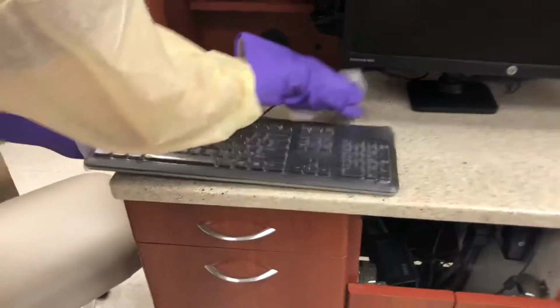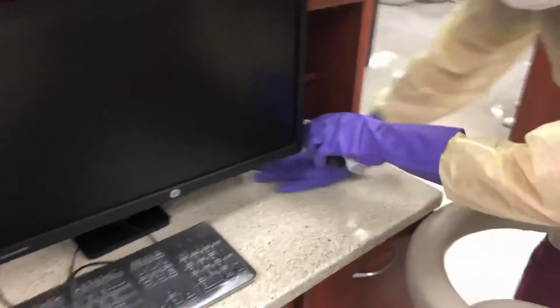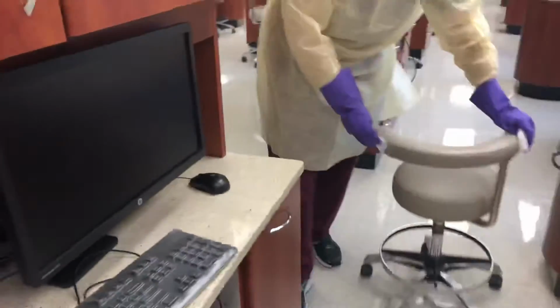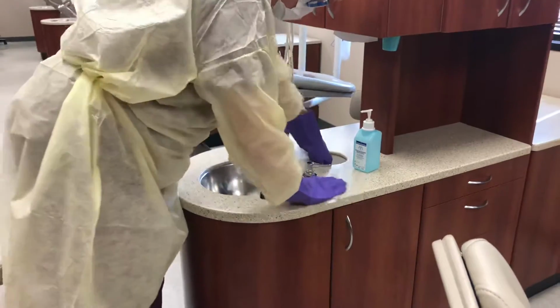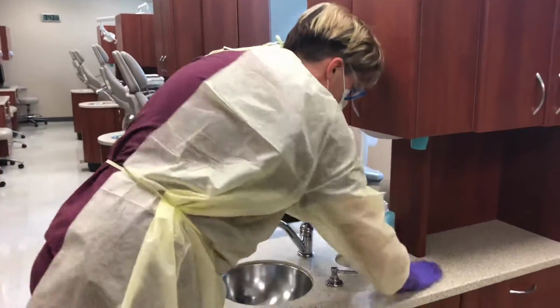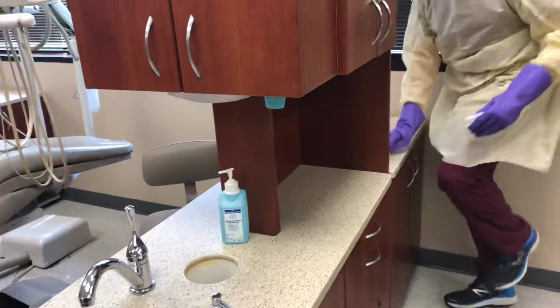Keyboard cover stays on at all times. Never take that off. It is wipeable. You will be sure to pick up the disinfectant bottle and wipe all around it. Wipe it and place it back down.